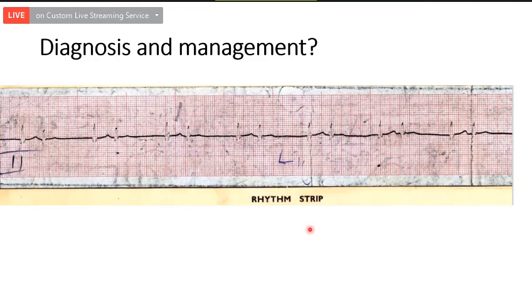Just like AV Wenckebach phenomenon, atrioventricular Wenckebach 3:2, you can get a sinoatrial Wenckebach phenomenon, 3:2. That can also give rise to bigeminal rhythm. So these are the few conditions where you can get a bigeminal rhythm. To recapitulate, Agnath, would you like to repeat? One more is there. I forgot to mention. Escape capture bigeminy. And another is echo bigeminy. So there are about 6 conditions where there can be bigeminal rhythm.